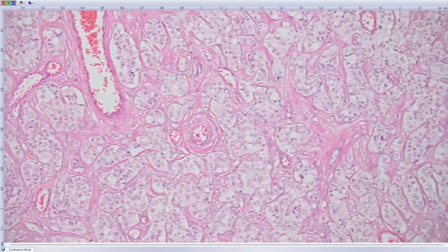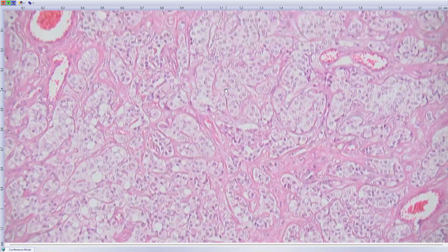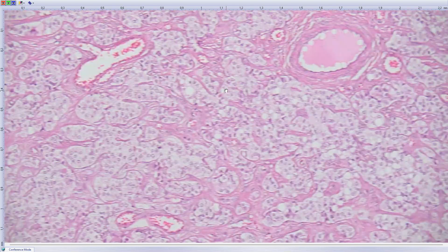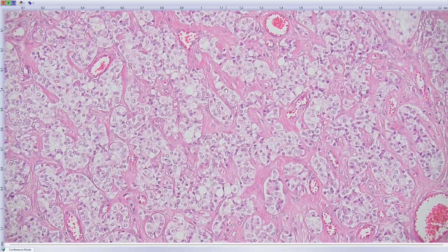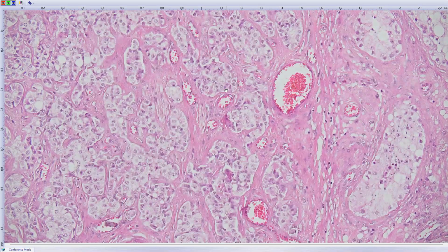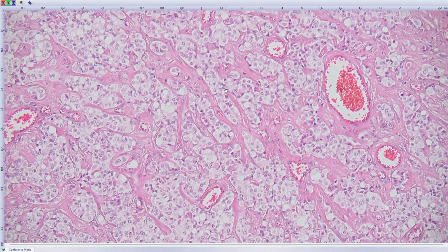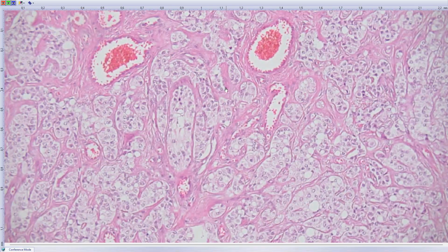The reason why this morphology is more typical in gonads and rather rarely seen in pancreas is that in gonads the tumors are usually smaller, because we find out earlier that there is some tumor mass, especially if it is in the testis, than in the pancreas, where the tumors can grow without knowing that the patient has the tumor.